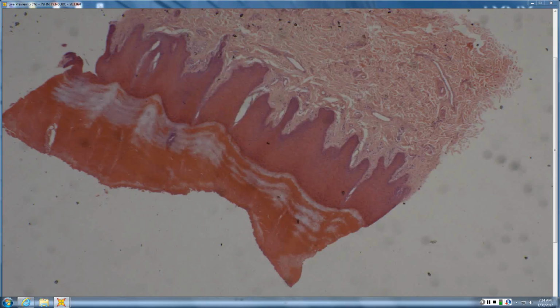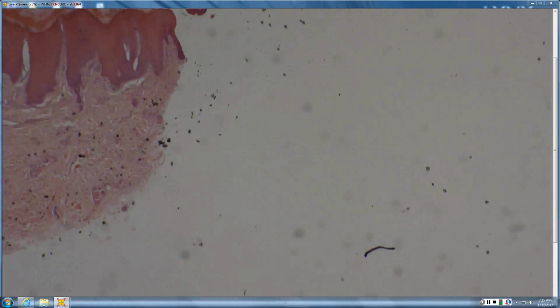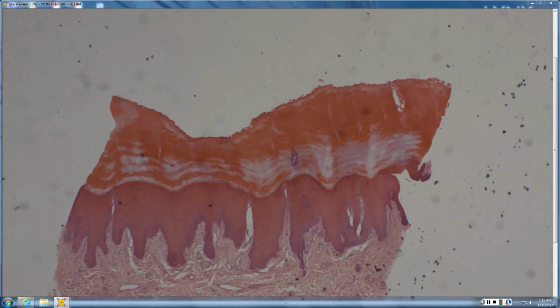Okay, this one is pitted keratolysis. This is number 8. And they're not always this awesome in terms of the dell that you see in the textbook. So here you see a very obvious kind of dell that's here in the thickened stratum corneum. And this stratum corneum is not thickened pathologically. This is acral skin, so it's kind of normal hyperkeratosis that you'd see, or just normal thickened stratum corneum you see in the acral location.